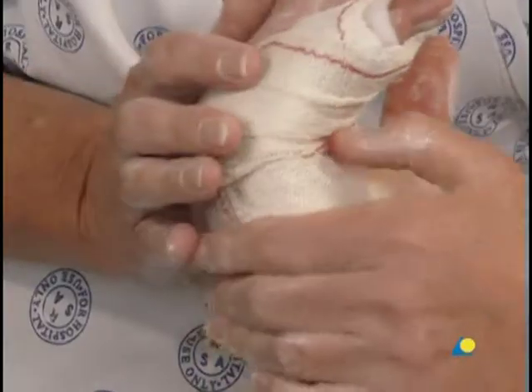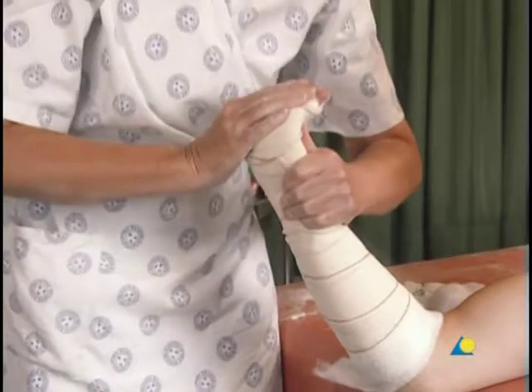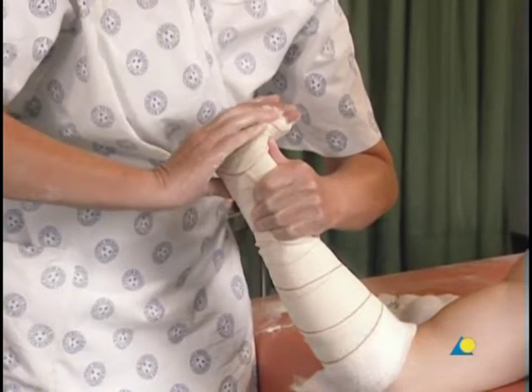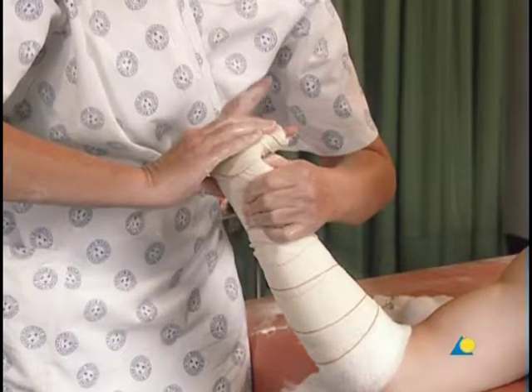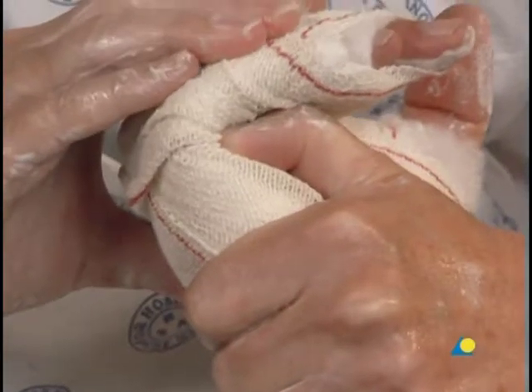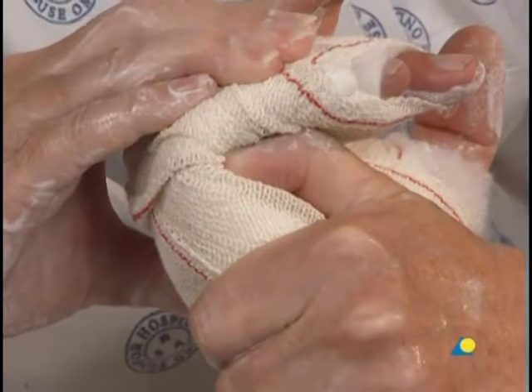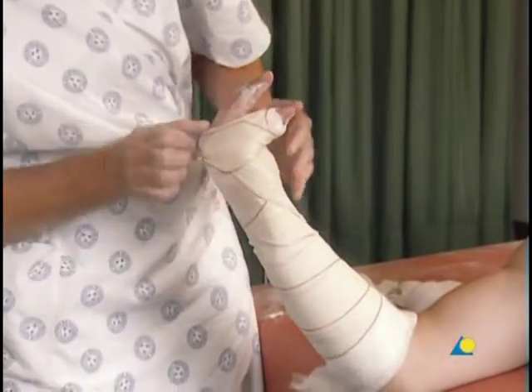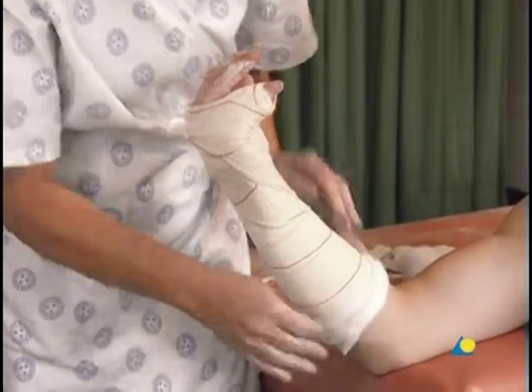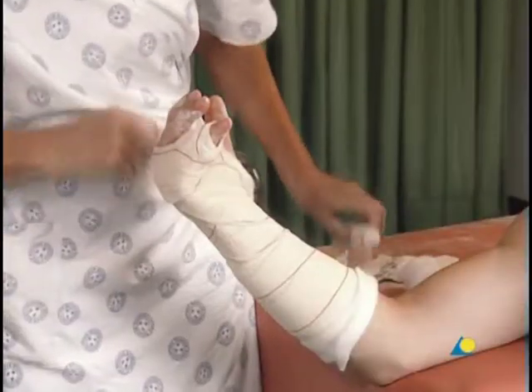The wrist is supported to prevent overflexion. The pressure is maintained until the plaster has set; however, the plaster will not achieve full strength for 36 hours. The cotton wool at the edge of the slab and the thumb is folded over to provide a softer edge, and can be secured with the leftover crepe bandage.